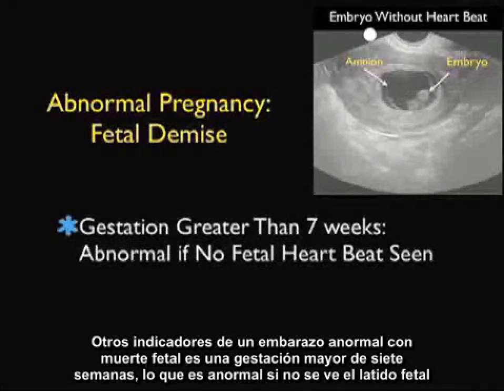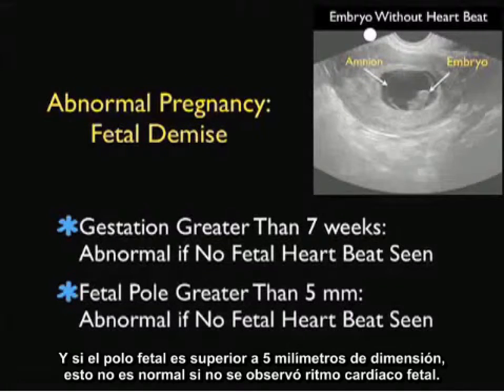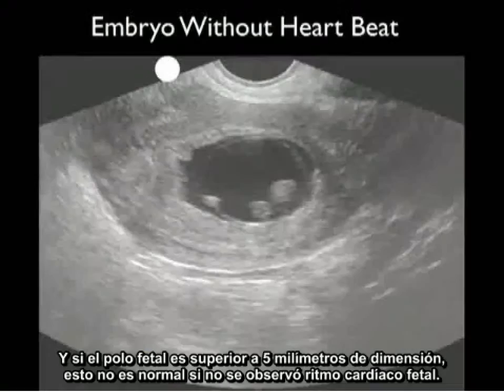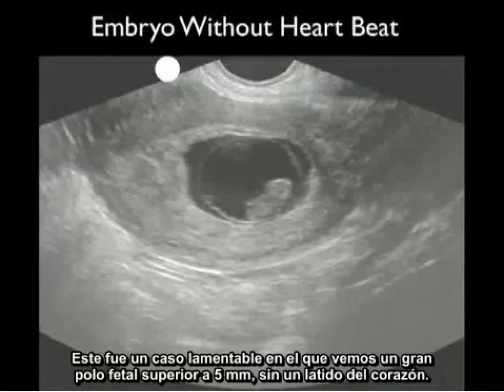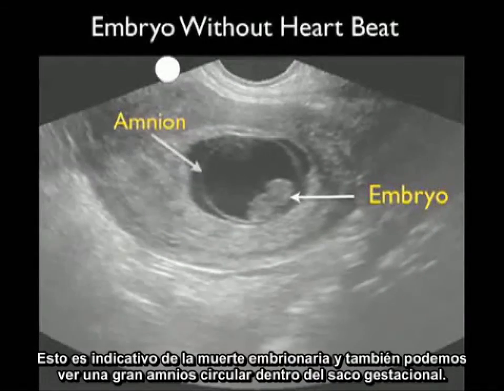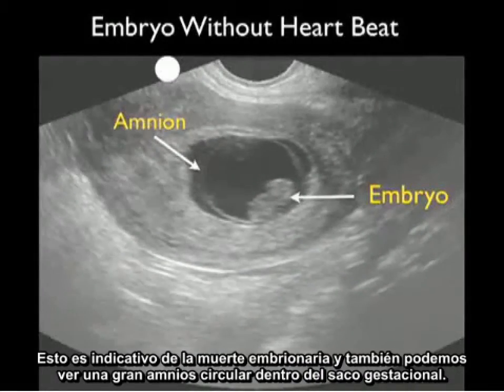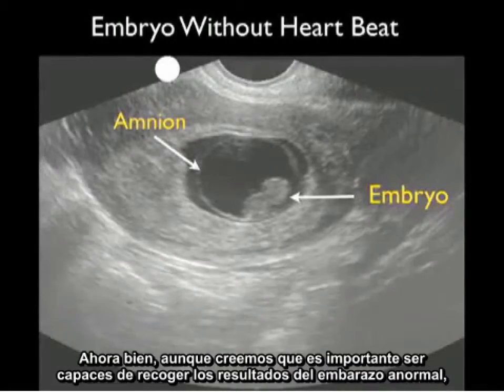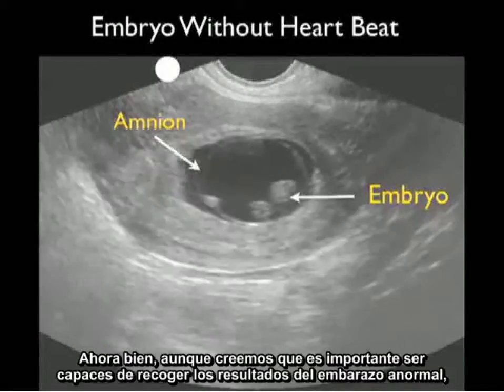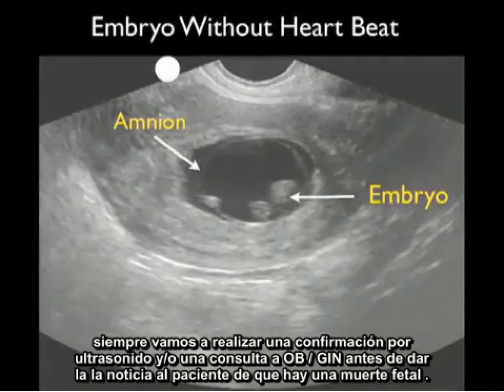Other indicators of an abnormal pregnancy with fetal demise include a gestation greater than 7 weeks without a fetal heartbeat, and a fetal pole greater than 5 millimeters without a heartbeat is also abnormal. This was an unfortunate case with a large fetal pole greater than 5 millimeters without a heartbeat, indicative of embryonic demise, with a large circular amnion also visible within the gestational sac. While it's important to pick up findings of an abnormal pregnancy, I always get a confirmatory ultrasound and/or OBGYN consultation before giving the patient the news of fetal demise.